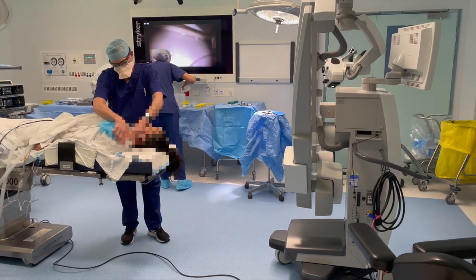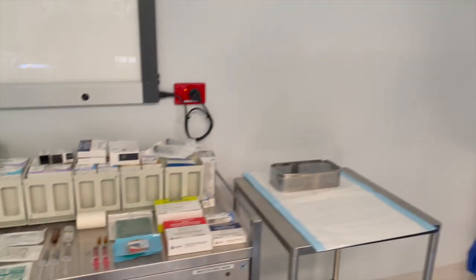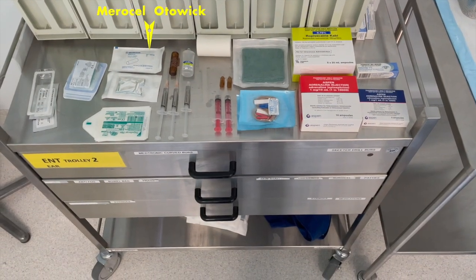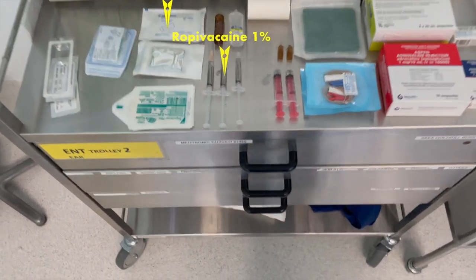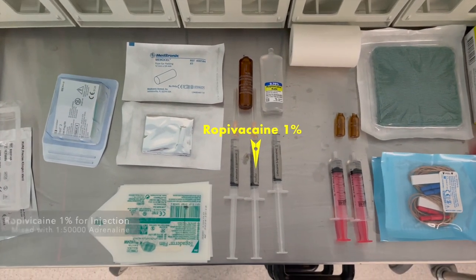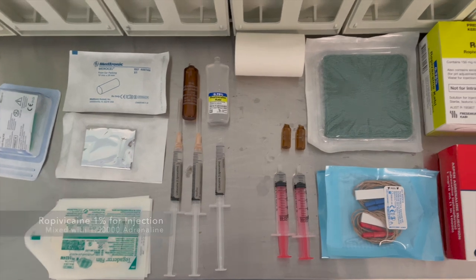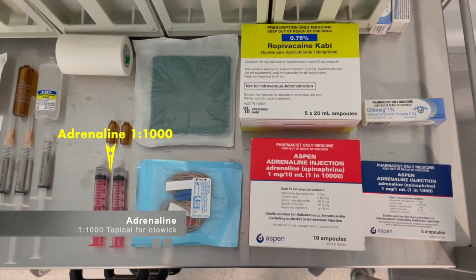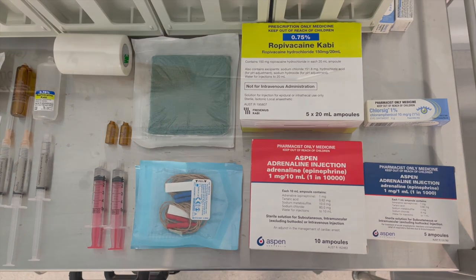Preoperative preparation is begun by our fellow Ben. A Merocel Otowick is required for canal packing, as well as 3 mL of 1% ropivacaine mixed to 1 in 50,000 adrenaline for injection, and 1 in 1,000 adrenaline drawn up topically for the Otowick. We can also see the Leukoplast and the facial nerve monitor.